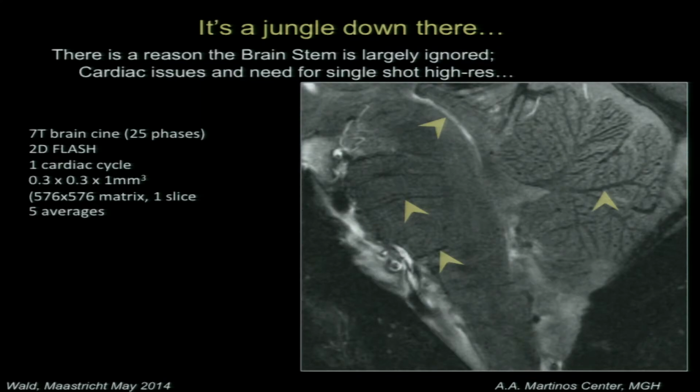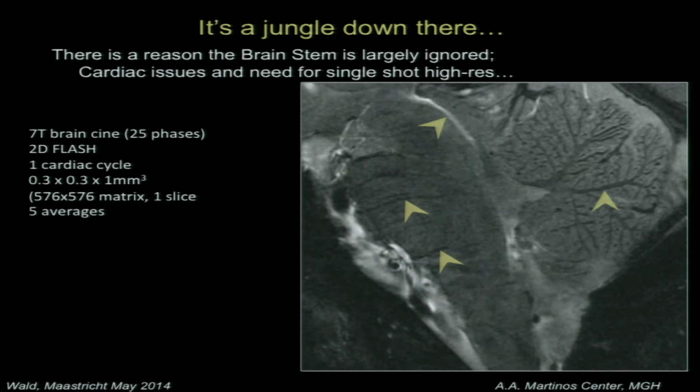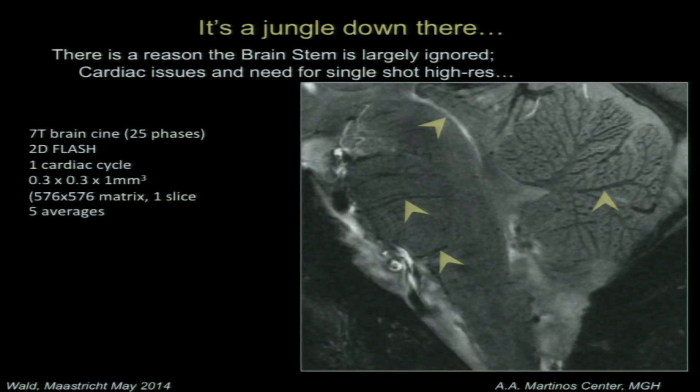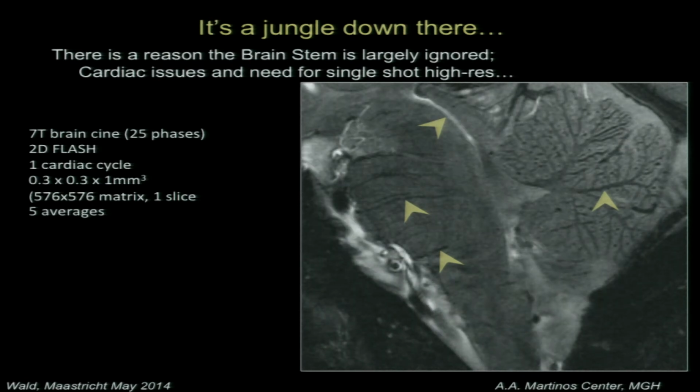The next thing, you look at the old articles showing the movement with the cardiac cycle. The idea is that somebody's tugging on the spinal cord like a bell cord and pulling the whole bottom of the brain down by millimeters. This is a cardiac gated cine, fairly high resolution, as you can see, FLASH. I think it's like a third of a millimeter pixel in plane. So it's looping through the cardiac cycle. And I put a few pointers so you can kind of get a reference.